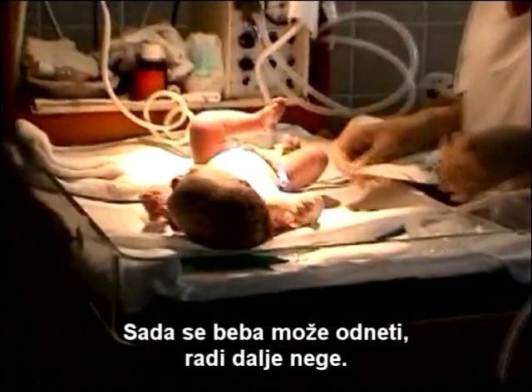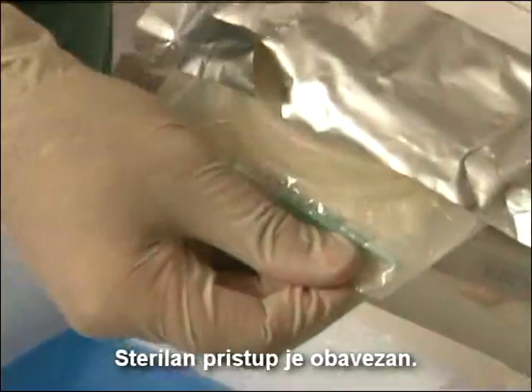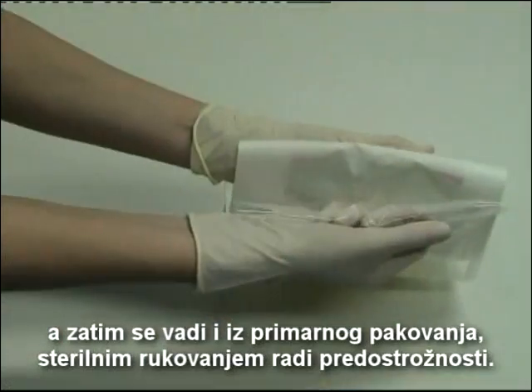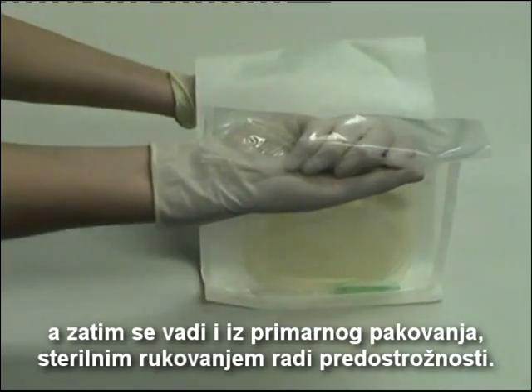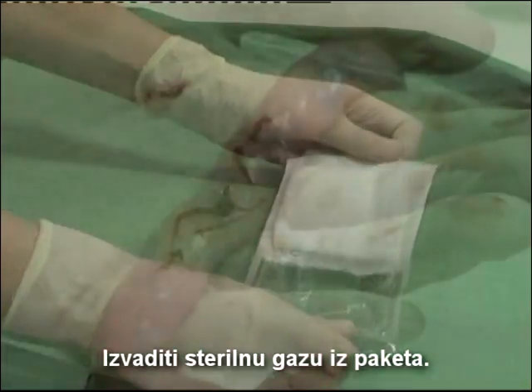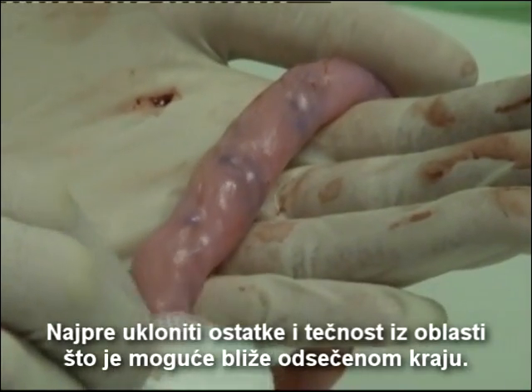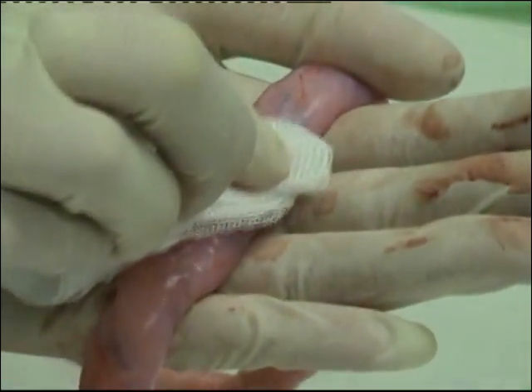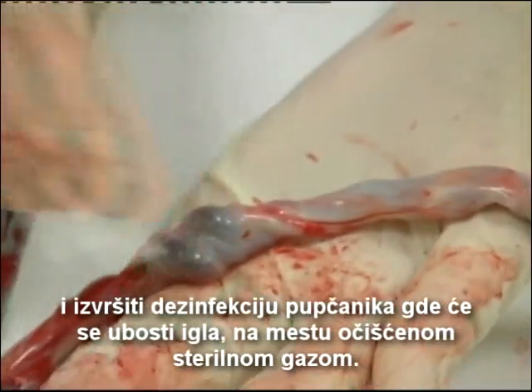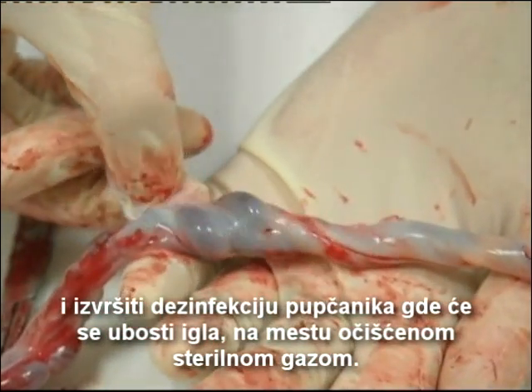The baby can now be taken away for further care. A sterile approach is mandatory. The blood bag is removed from its secondary package, and then removed from its primary package using sterile handling precautions. Remove the sterile gauze swabs from the package and first remove the debris and excess fluid from the collection area as close as possible to the cut end. Remove one of the sterile alcohol pads from its package, and liberally disinfect the umbilical cord where the needle will be injected, in the area which was cleaned with the gauze swab.